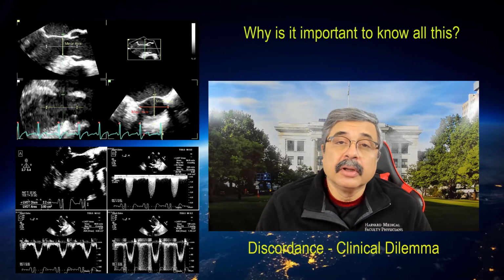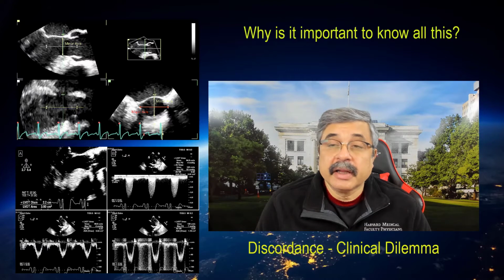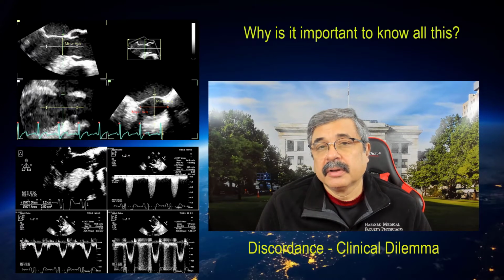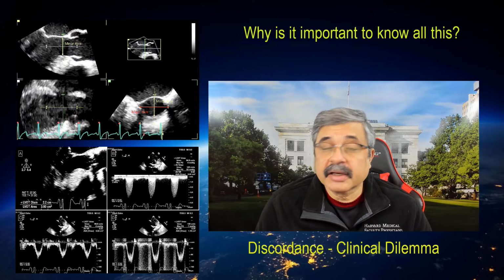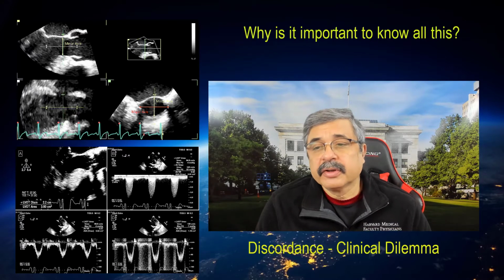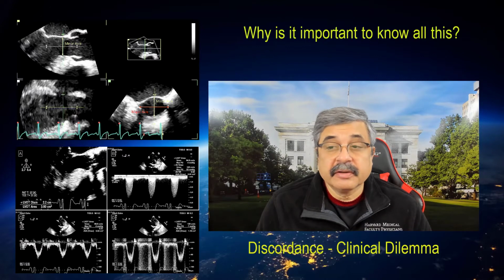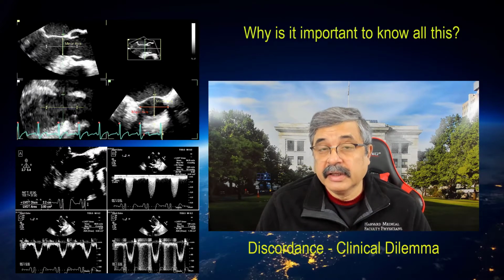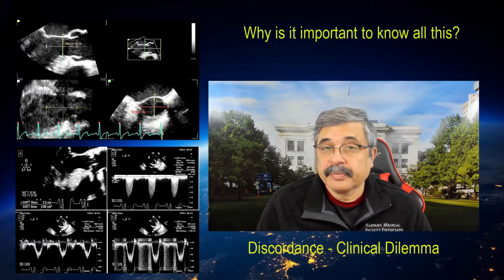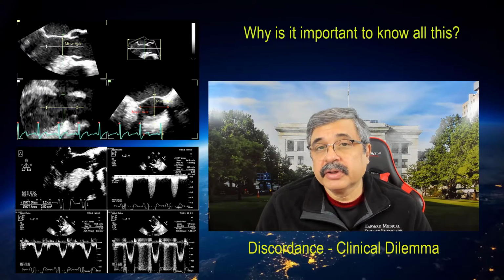Therefore, it is not uncommon to encounter discrepancies in the operating room with consequent clinical and echocardiographic dilemmas in decision-making. The discordances in areas calculated in the cath lab as well as in the operating room are often attributed to the difference in methodology of aortic valve area calculation and estimation of the effective orifice area versus the geometric orifice area, and the peak estimation of gradient using echocardiography, which measures the instantaneous peak gradient as opposed to the cath lab gradient, which is non-instantaneous, and also the difference between peak and peak between the LVOT and the ascending aorta.